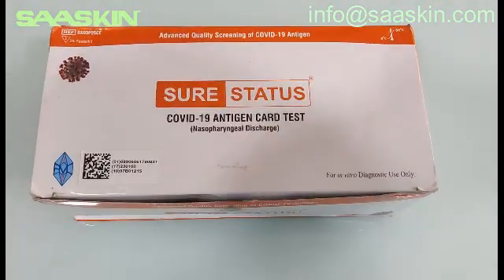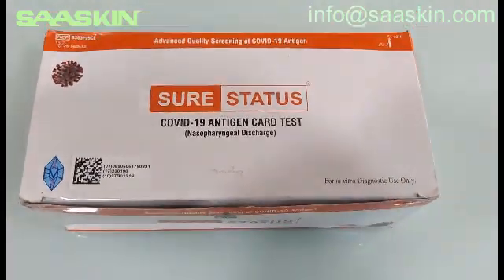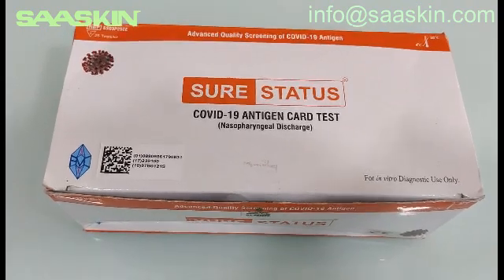Today we are going to see about the SureStatus COVID-19 Antigen Test Kit. This is a CE certified, WHO approved, and ICMR approved kit.